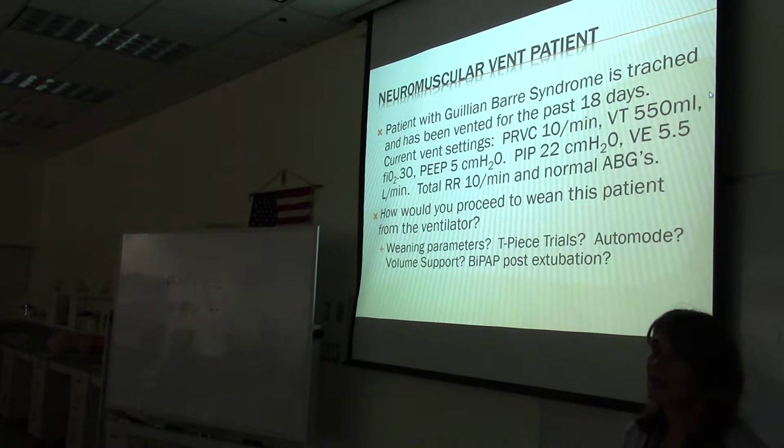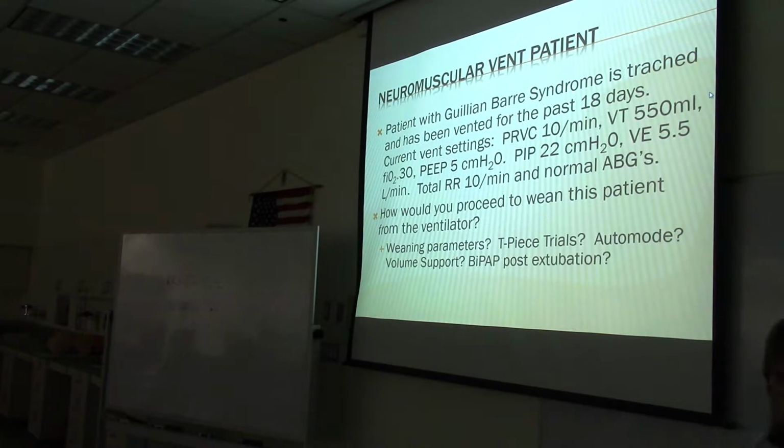Yeah, and what if they're staying in auto mode all the time because they're too weak to initiate a breath? So, if they're not able to initiate a breath, then they'll just ride in full support the whole time. Would you try SIMV? SIMV with these patients, where you're giving them some breaths per minute?